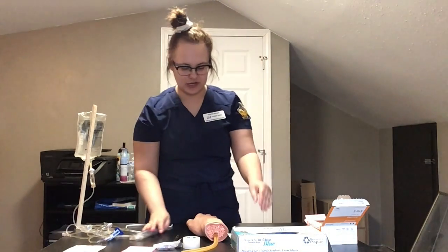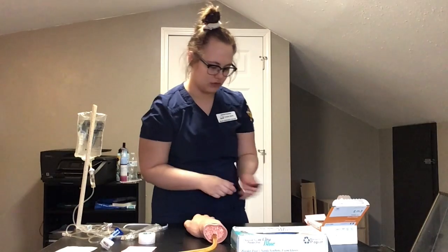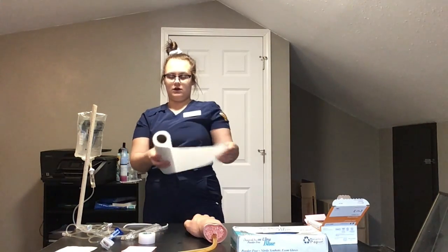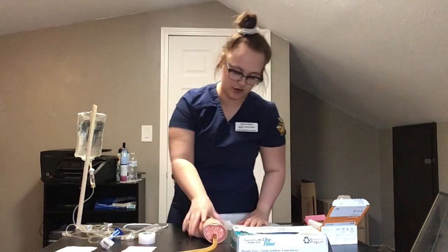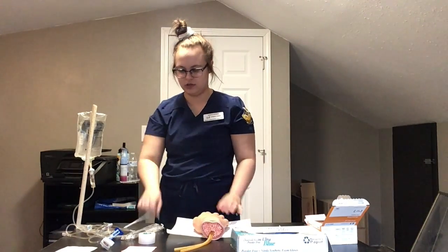Then I would get my patient and place him in a comfortable, dependent position. I would place a linen saver underneath him or her, and then I would get my tourniquet.